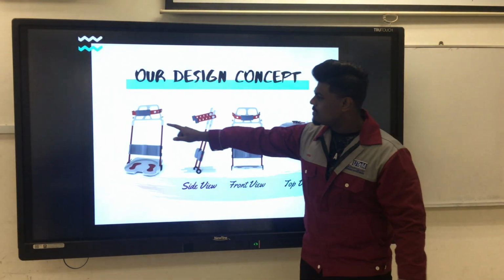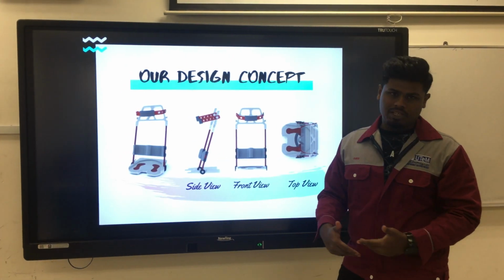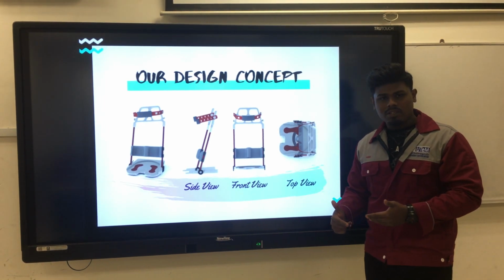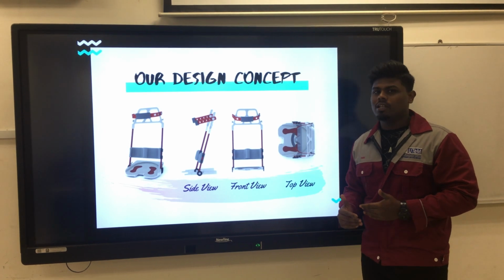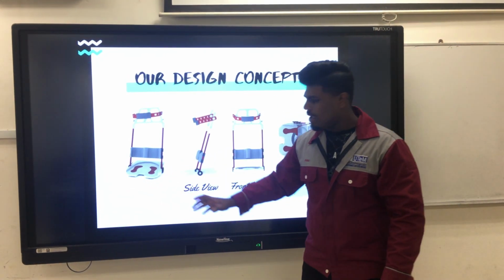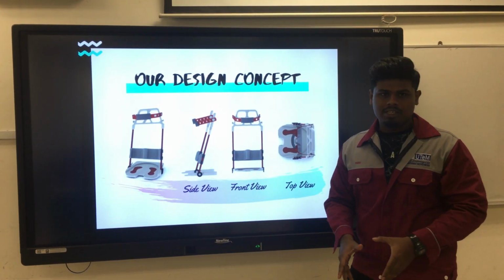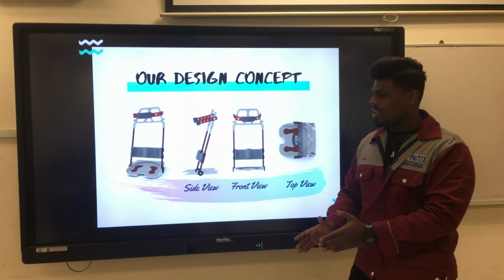Now, let's look into the strap, where we have adopted the sit to stand position of the patient or the immobile person, where the people that we are going to transfer have to be seated first in order to be transported to another place. Now, we also have this base where it will convey the person onto it and then simply transport it to another place.